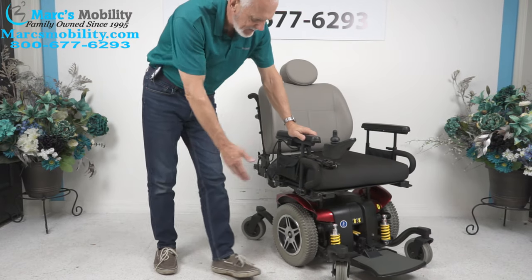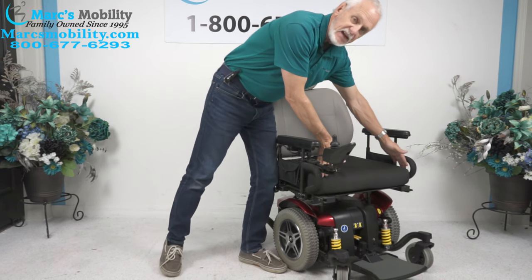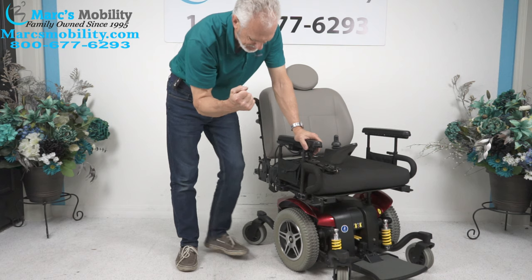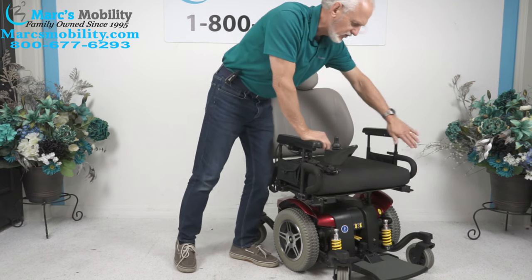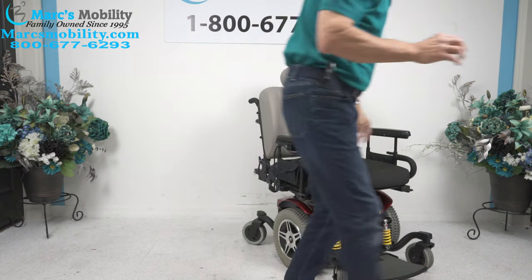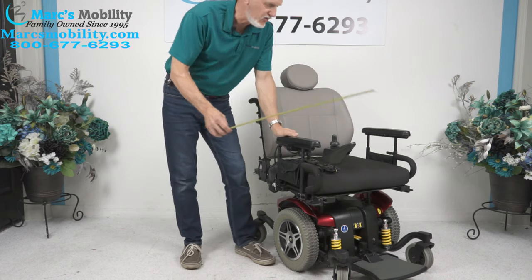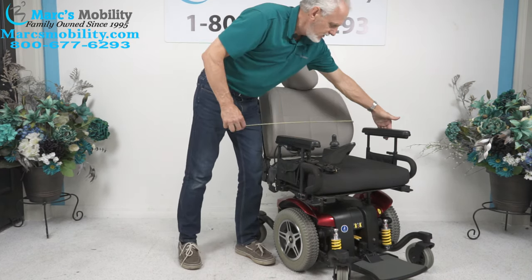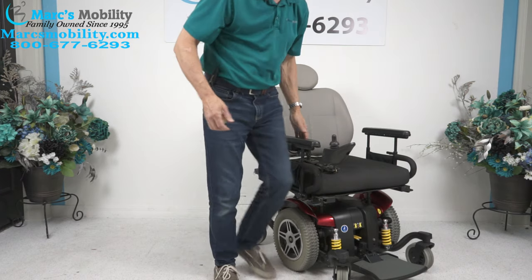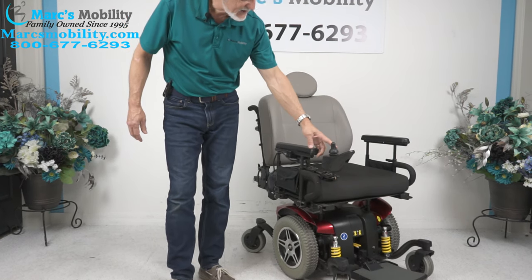Let's recap: this is the Jazzy 614 HD, with a 450-pound weight capability. The seat is 22 by 20 deep. It has a safety belt, a little bag on each side, front suspension, and a joystick on the right that can be switched to the left if you're left-handed. Total width is 26 inches because of the larger seat — the wheels are only 25 inches, but the seat makes it 26. It's a really nice, quiet chair — the 614 HD by Pride Mobility.